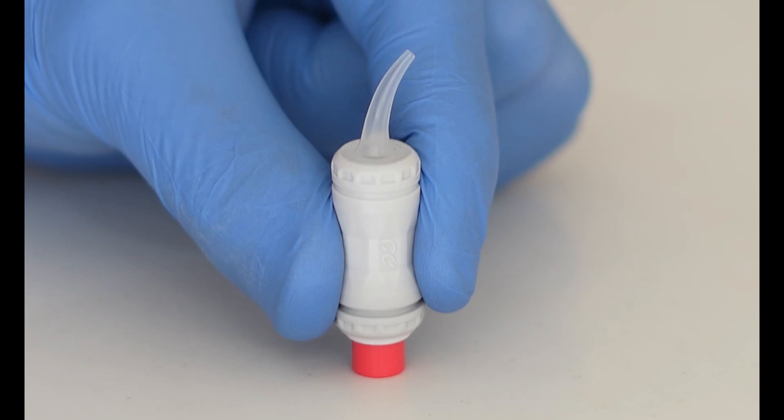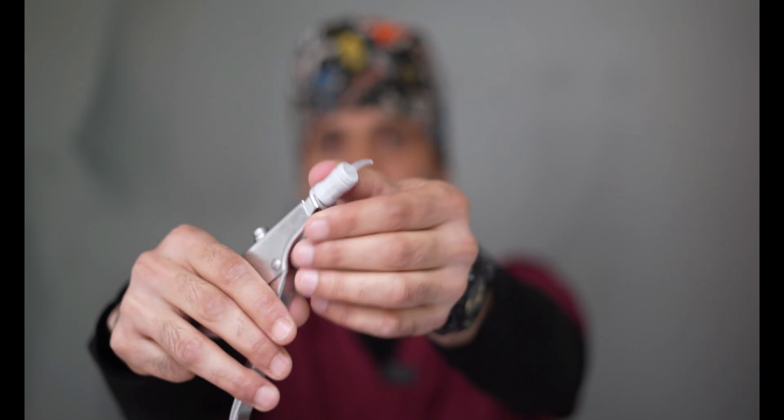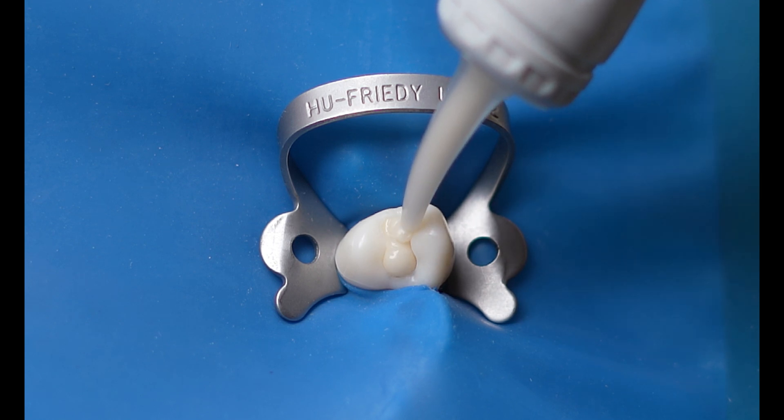Lastly, I will talk about the handling of the material — it's amazing. All you need is to activate the capsule by depressing the plunger, place the capsule in the triturator for 10 seconds, and apply three clicks in the capsule applier. Then deposit the filling directly into the prepared cavity. That's all you need. This material does not stick to your instrument and there is no pullback.